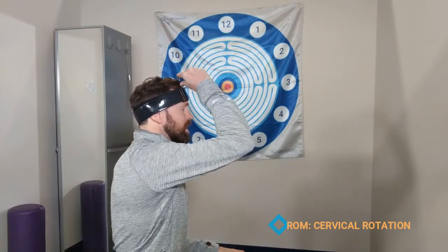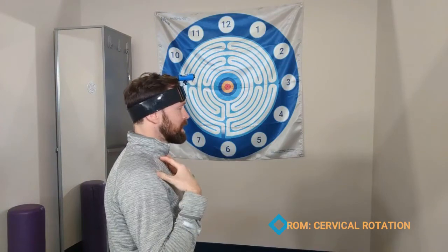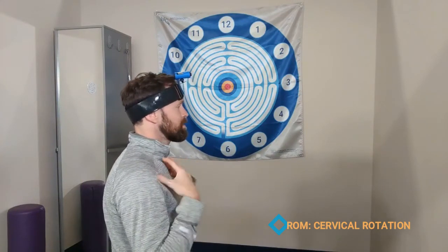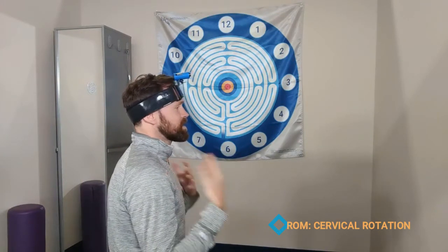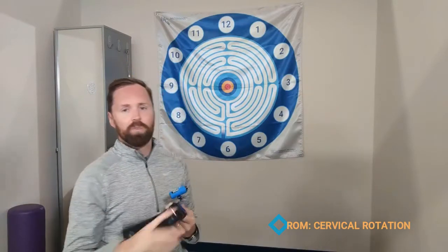The only cue you have to be careful with here is just making sure the client isn't rotating their torso. You can simply hold their shoulders lightly or just give them a cue to keep the rest of their body still. Again, you can apply that to any direction — rotation right, left, up, down. You can use different numbers and targets to make this more interactive with your clients.